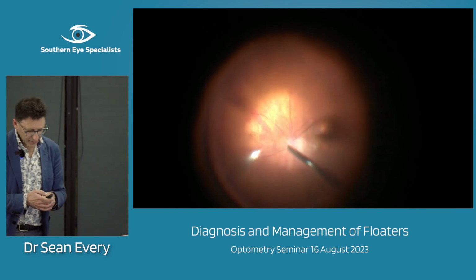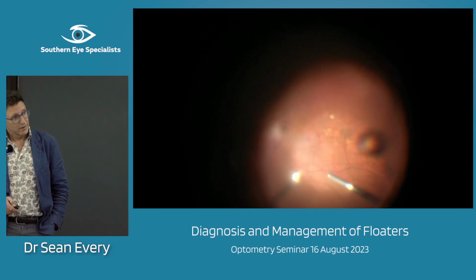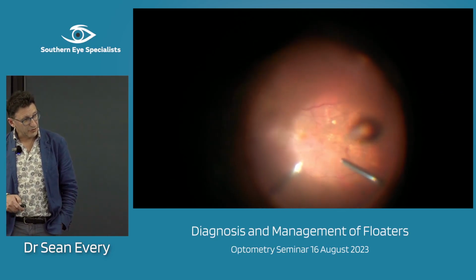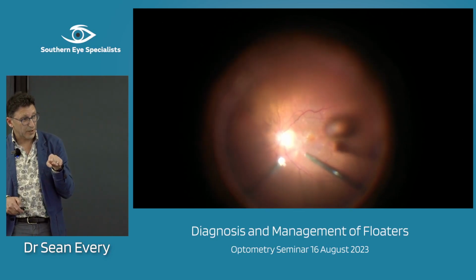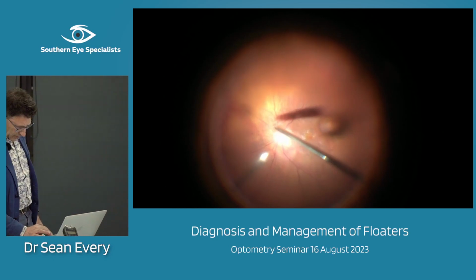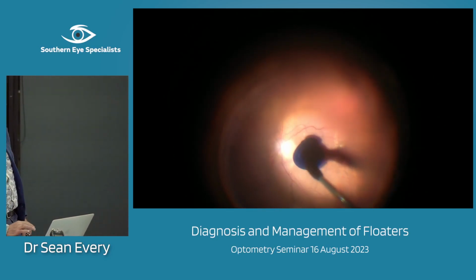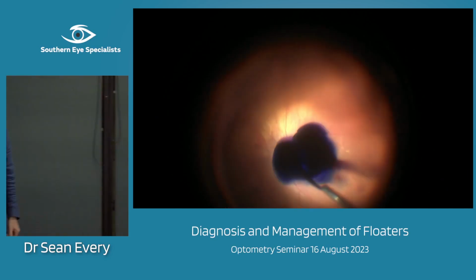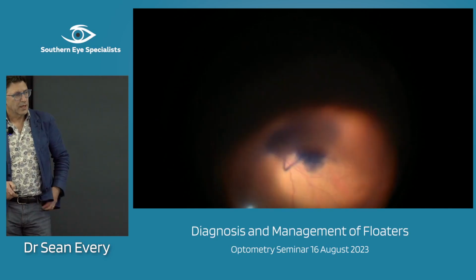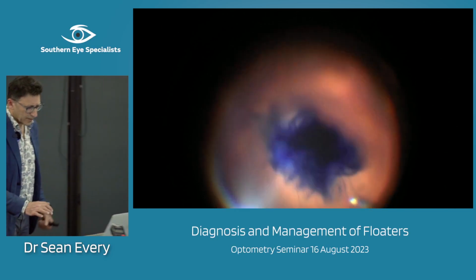This person, yeah, this poor bugger, it was his only eye. Asteroid, he's had a submacular hemorrhage before in the past. He actually has got vitreopapillary traction, so the whole thing's pulling on his disc as well. So there's quite a... I'll just fast forward. I don't know where I might... I haven't gone through and edited these videos, but you stain with this beautiful blue dye. I think I've peeled it. Yeah, so I've peeled it away by that stage.